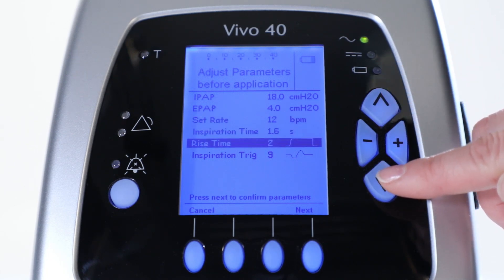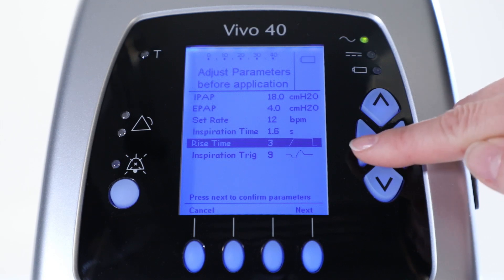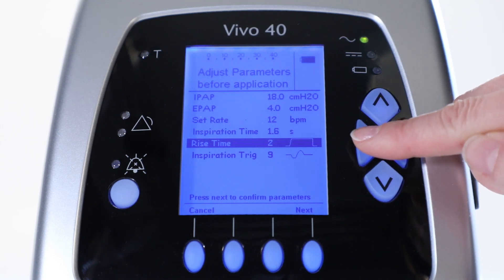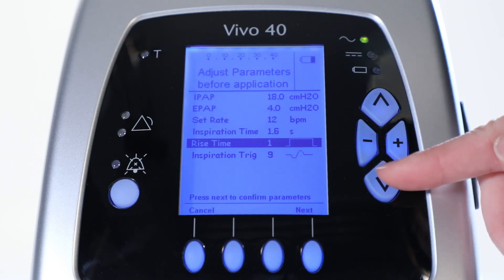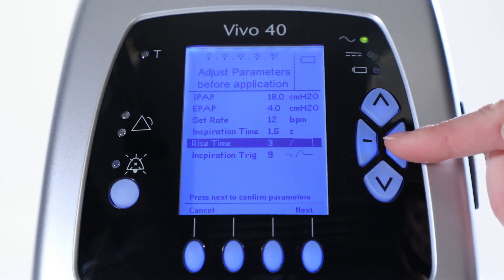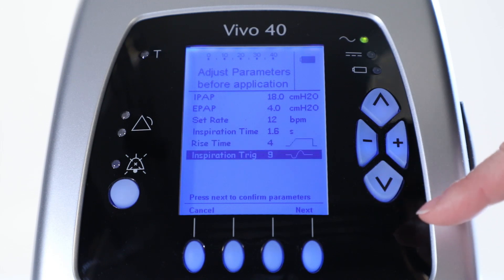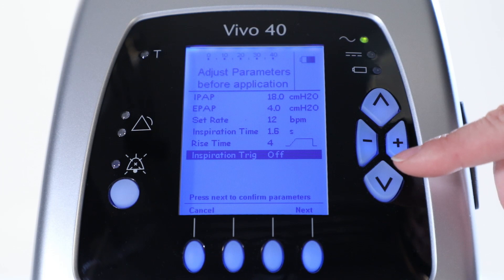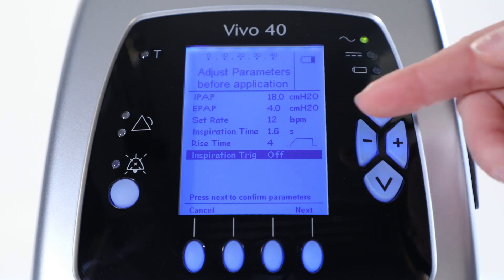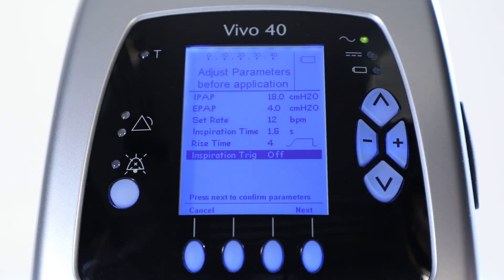Then you select the rise time to increase or decrease the peak flow when the air is delivered to the patient. In this case we will choose 4. And last, choose a level of inspiration trigger to allow the patient to trigger a breath in a comfortable way. In this case we won't allow the patient to trigger a breath by choosing off.